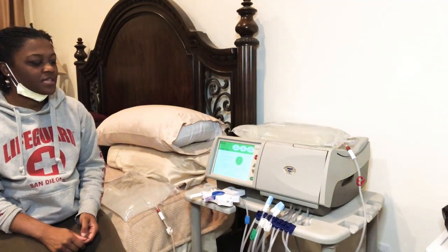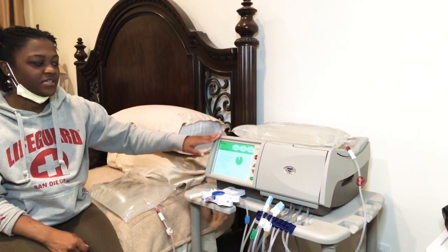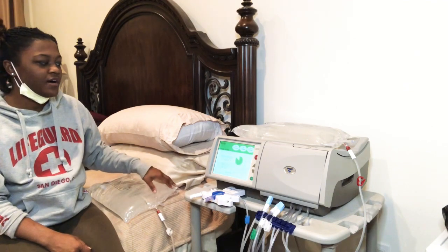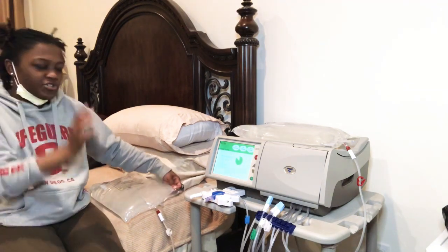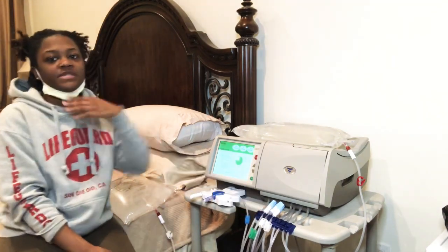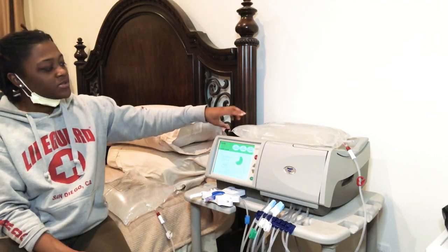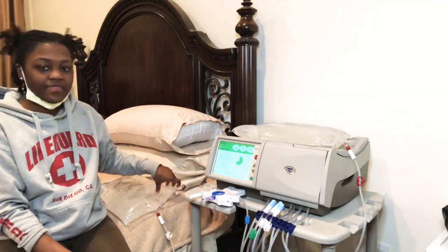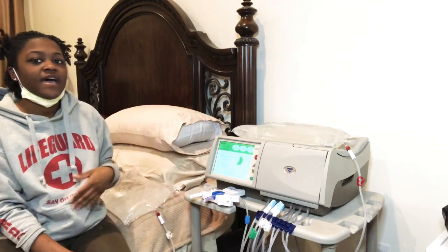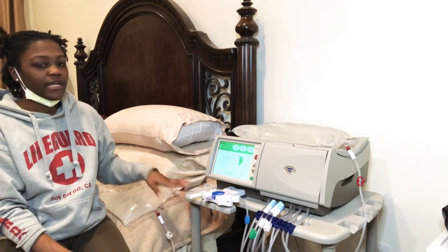And then now this is just verifying the bags that are connected to see if it matches up with your treatment, to make sure that you have enough bags, enough medicine for your treatment basically. My treatment's 8,000, so there's 5,000 milliliters in each bag. So together these 2 bags, it's 10,000. So I'll have a balance of 2,000 milliliters that I don't use, which I just pour out in the morning when I'm breaking down my machine.